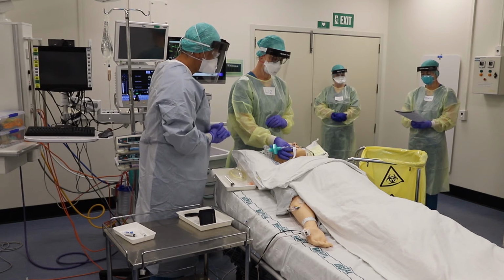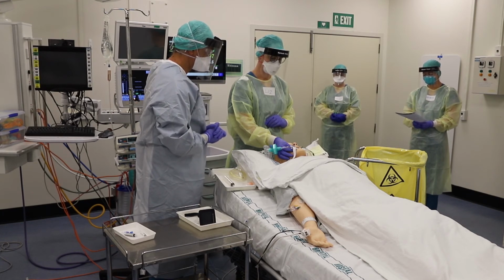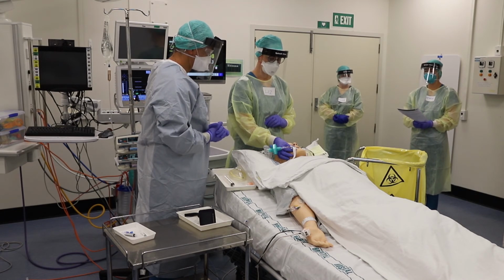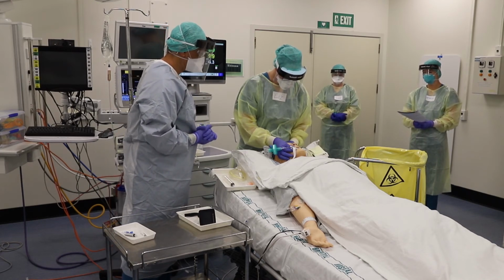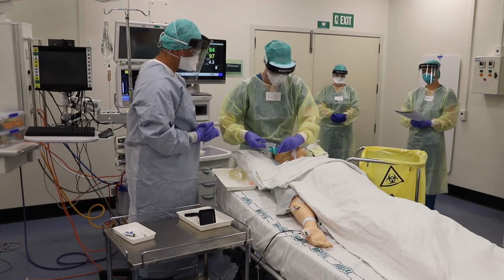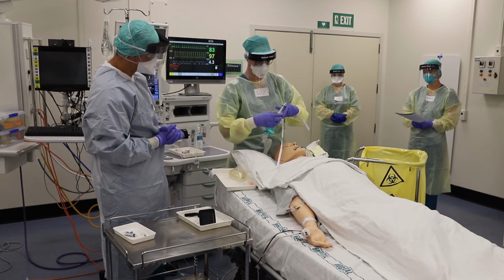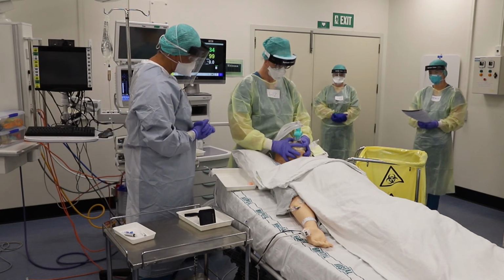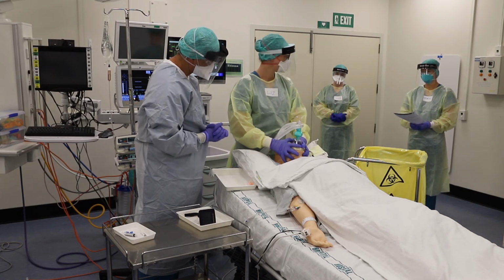Please listen to this full statement before starting. When ready, anaesthetist deflate cuff, remove ET tube and place into bin. Face mask to be immediately applied by anaesthetist using two-handed technique while respiration is assessed. Kevin, take some nice big breaths for me. That's good. Now open your eyes. Take another big breath. Okay, deflating the cuff. Sure. Okay. Still breathing nicely. That's good.